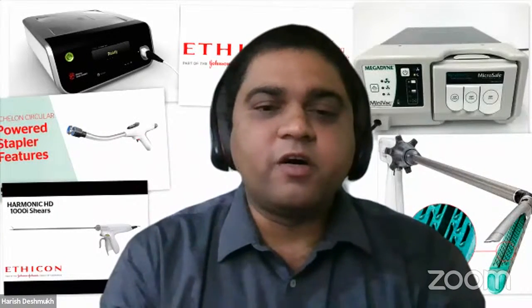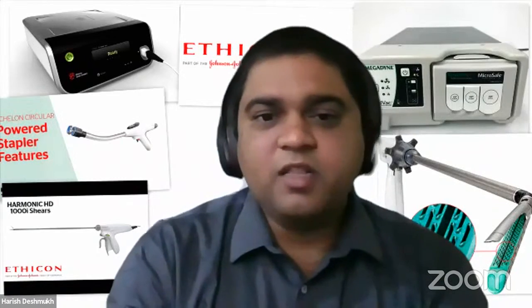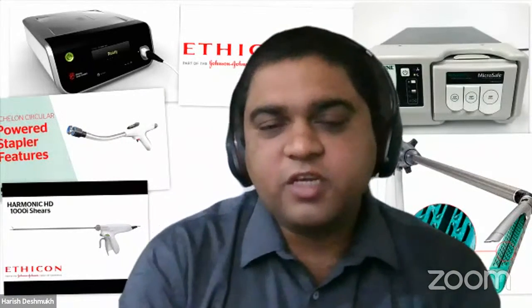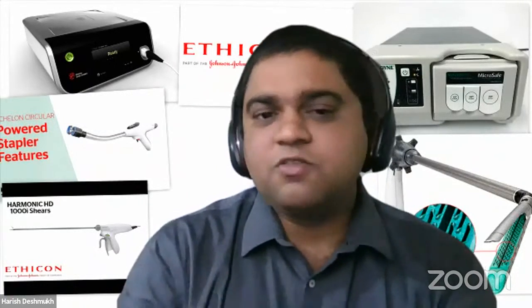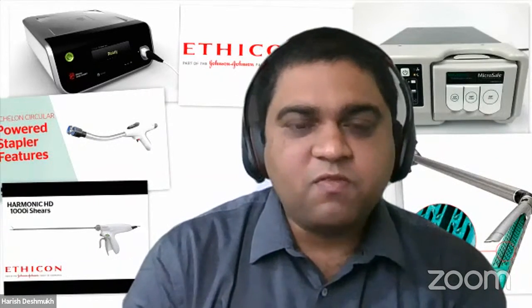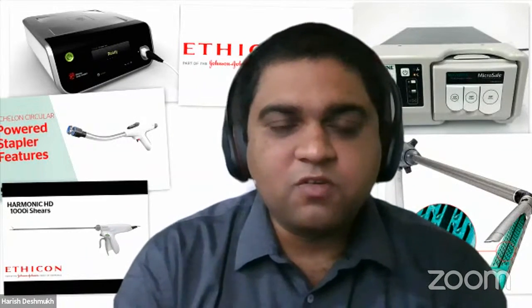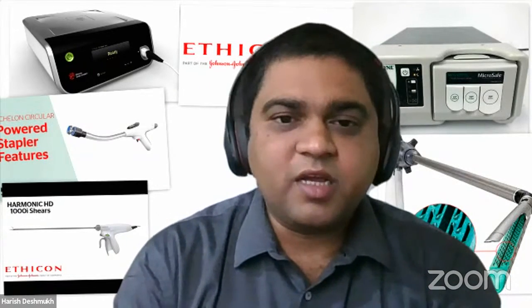If it is radiated tissue or the patient has some other comorbid condition, then we have to take a call based on that whether to use blue or green. Or in case you still have a doubt between blue and green, you can always go with the gold, which gives you an intermediate tissue thickness. Blue gives you a 1.5 mm closed staple height, whereas green gives you a 2 mm closed staple height. But gold will give you a 1.8 mm closed staple height.